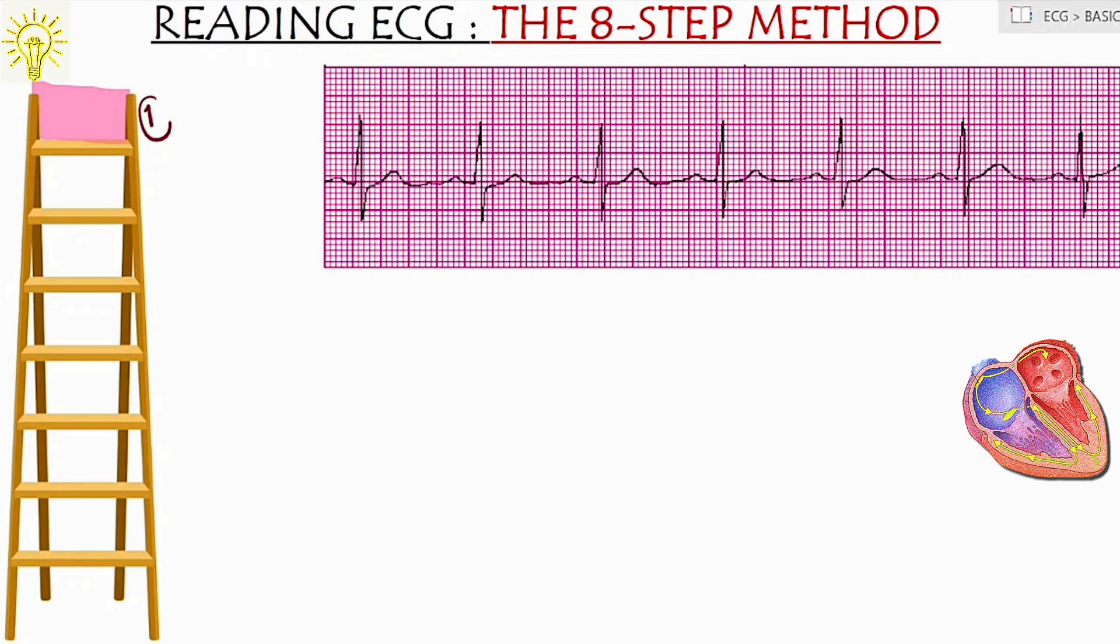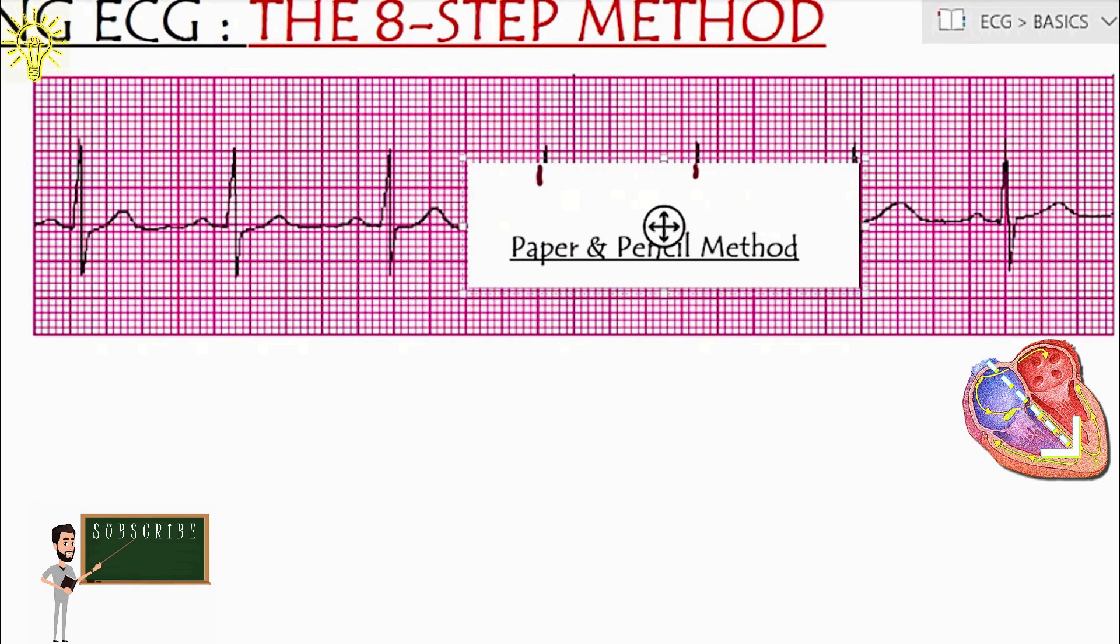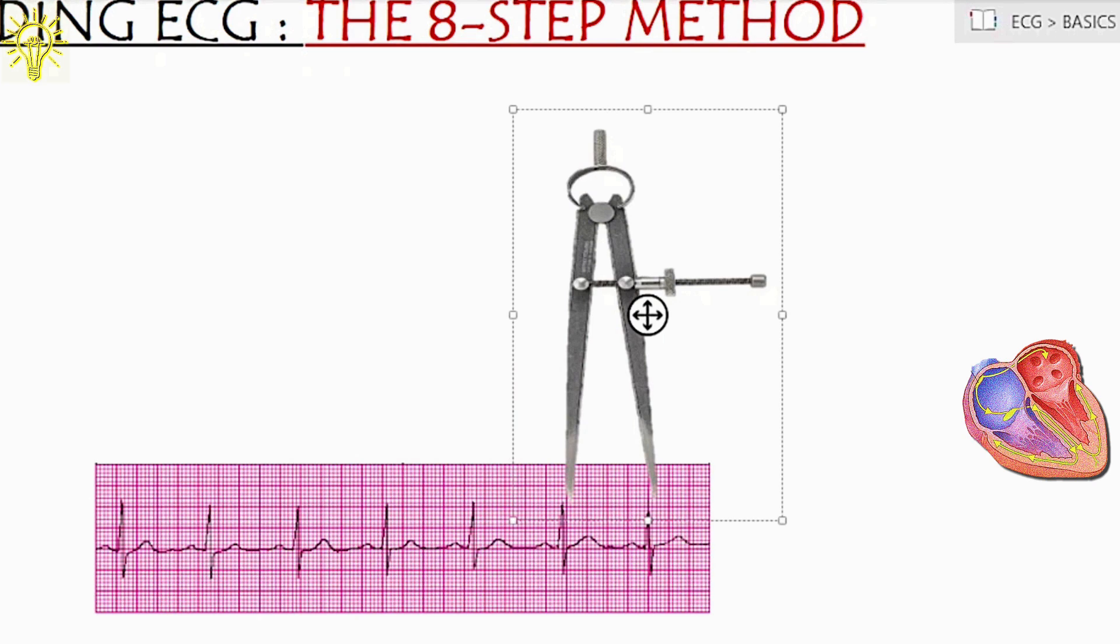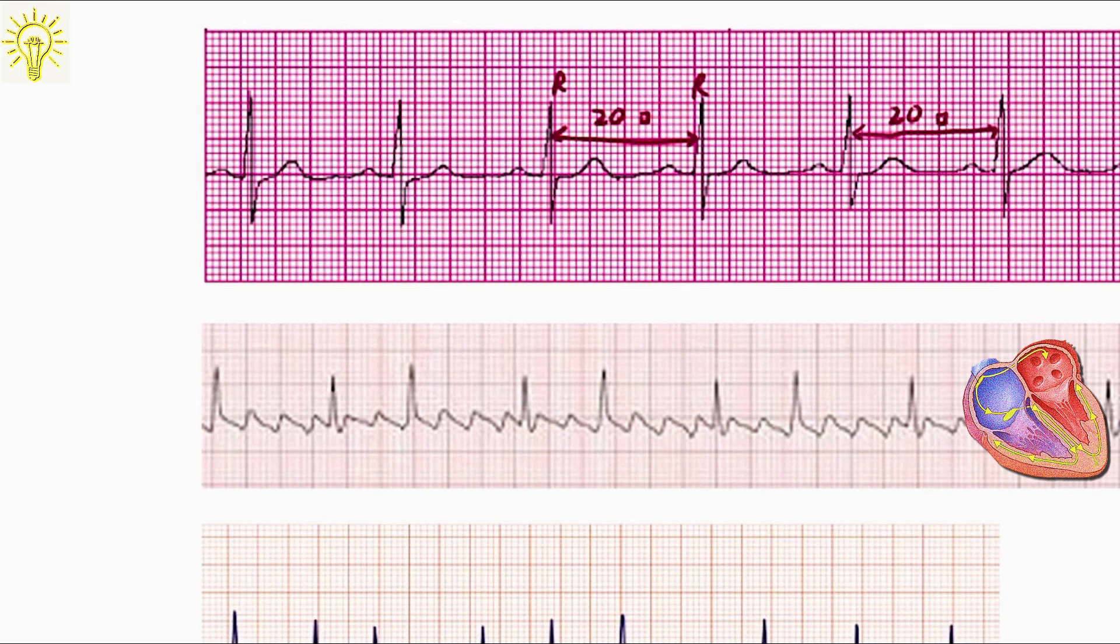Step 1: Check the rhythm. Place a paper on ECG strip right on top most point of R wave and mark two successive R waves. Now, tally the markings on paper with other R waves. In the first ECG strip, we have four large boxes or 20 small boxes between successive R waves at different points. So, we declare the rhythm as regular.